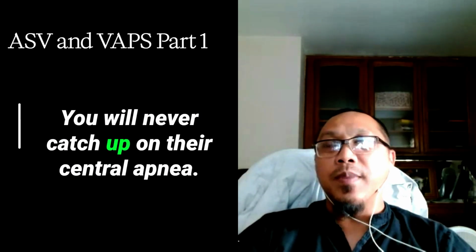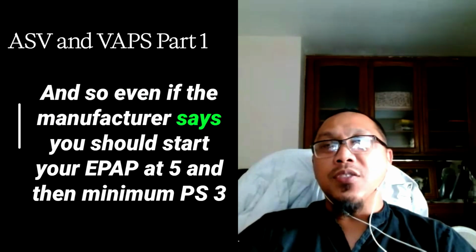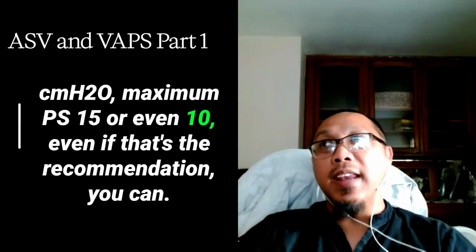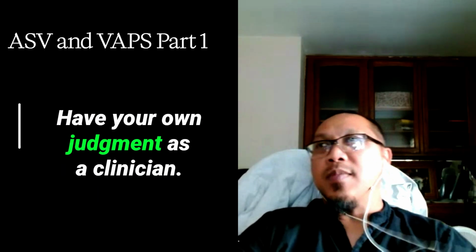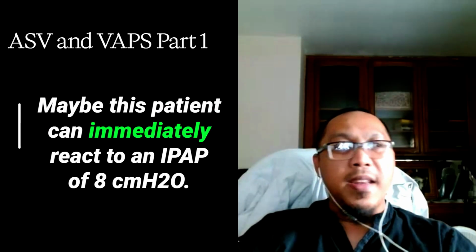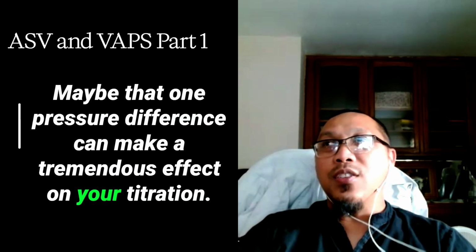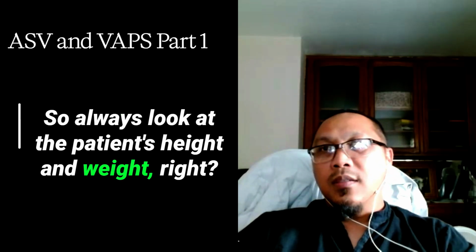Yes, because you don't want to start at a higher pressure and overventilate your patient. You will never catch up on their central apnea. And so even if the manufacturer says you should start your EPAP at 5, and then minimum pressure support 3, maximum pressure support 15, or even 10, even if that's the recommendation, you can use your own judgment as a clinician. My patient is tiny. Maybe this patient can immediately react to an IPAP of 8. Maybe that one pressure difference can make a tremendous effect on your titration. So always look at the patient's height and weight.